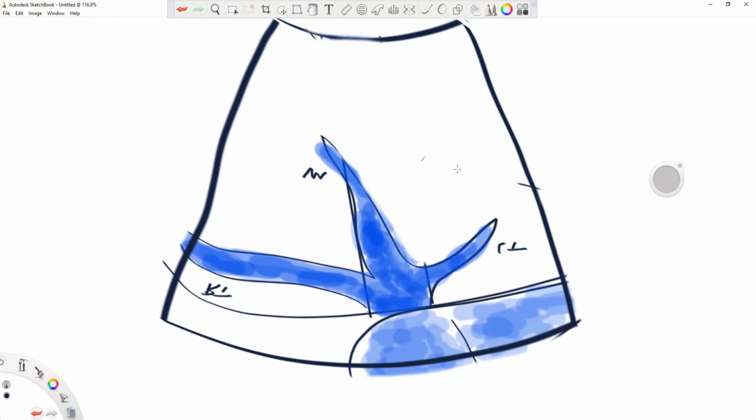Now, kind of a three-legged stool again. We don't often see all three of these perfectly well. You might see two, and then you have to turn a little bit in order to see the third one. But sometimes we do see this. And so remember now, this is right, middle, and left. We're just seeing it upside down.